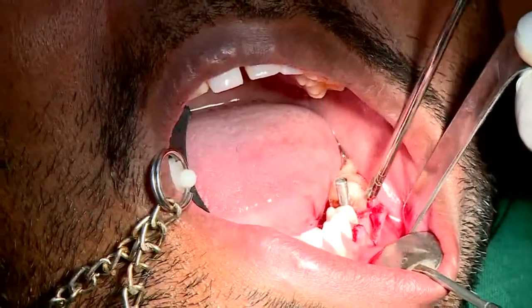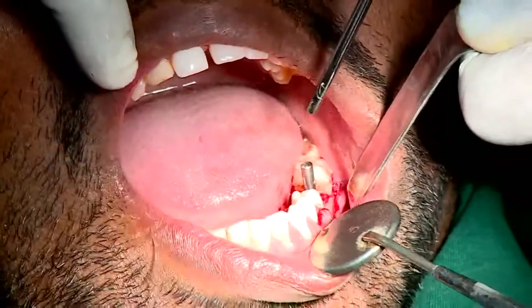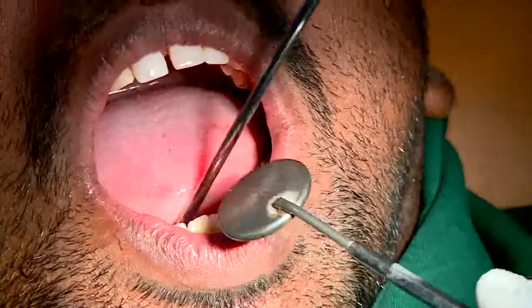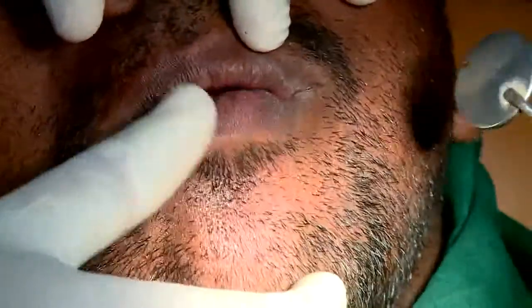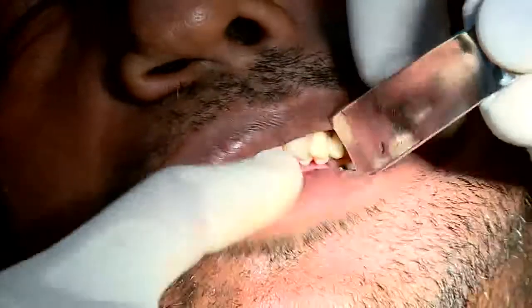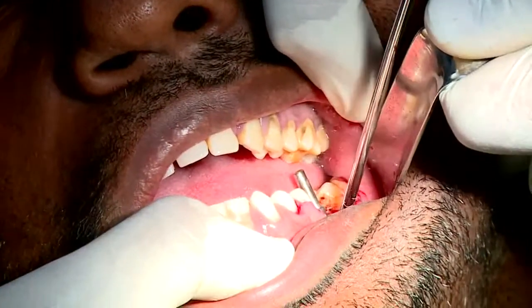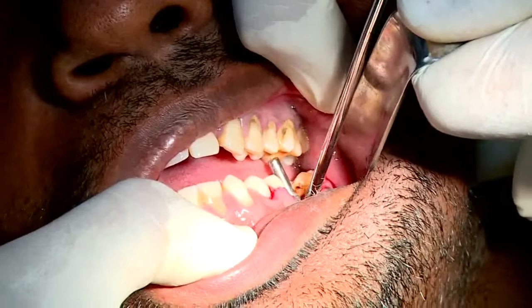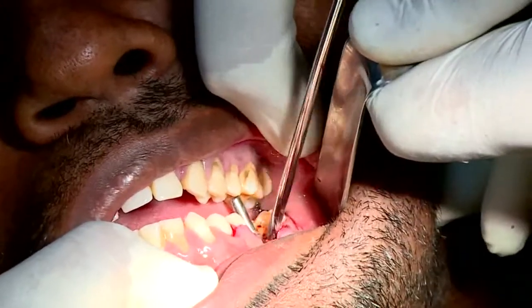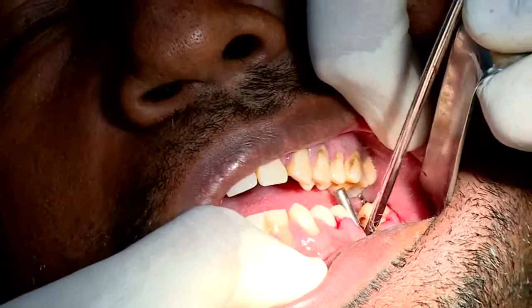And then right now I am going to take off this mouth prop. I am going to ask my gentleman to gently close his mouth. Close the mouth a little, turn to this side. Now close the mouth. You can see the potential place where this implant will emerge. Can we see it at all? Yes, sir. You can see that it is exactly in occlusion with the opposing tooth.